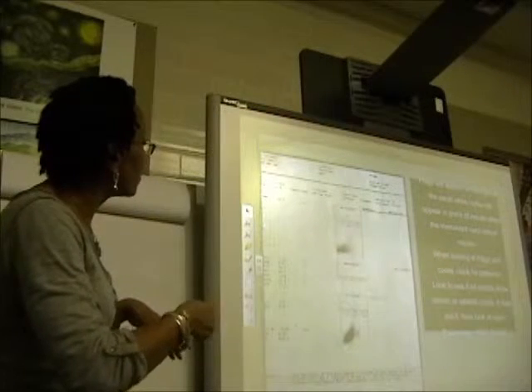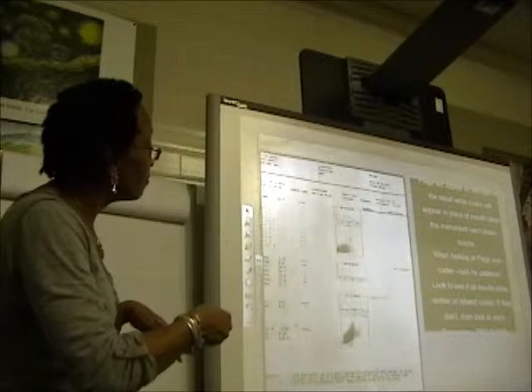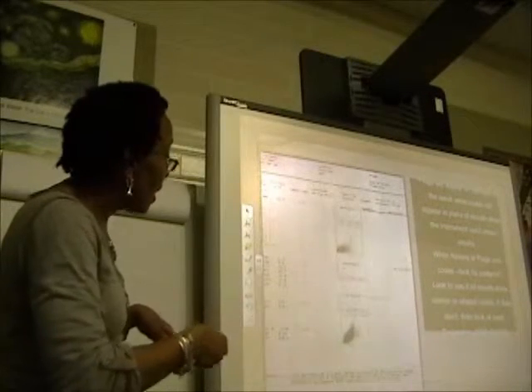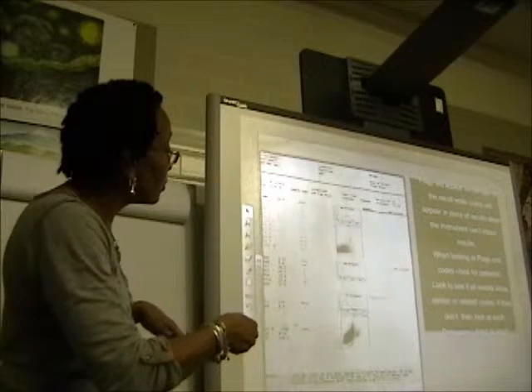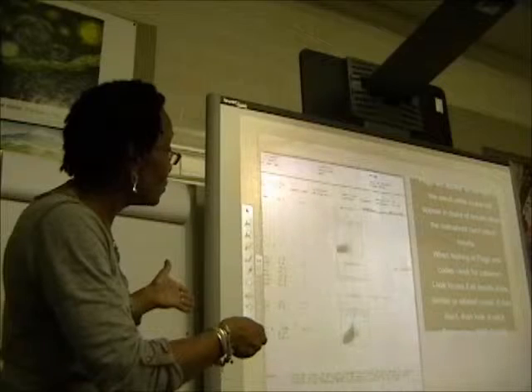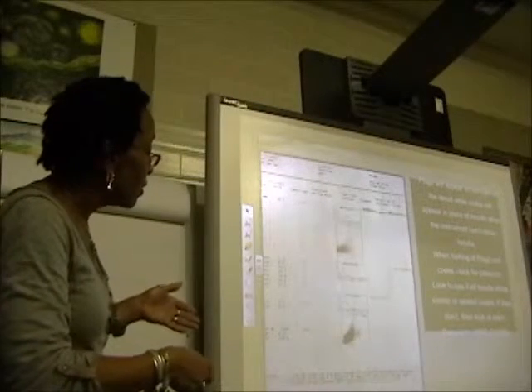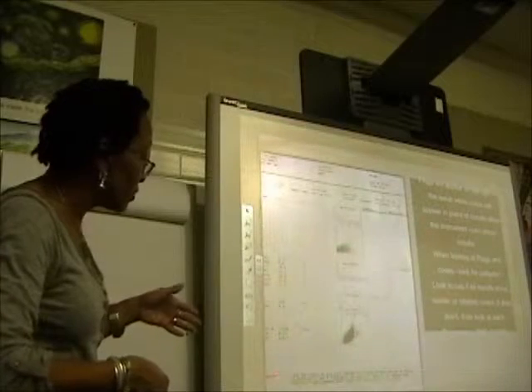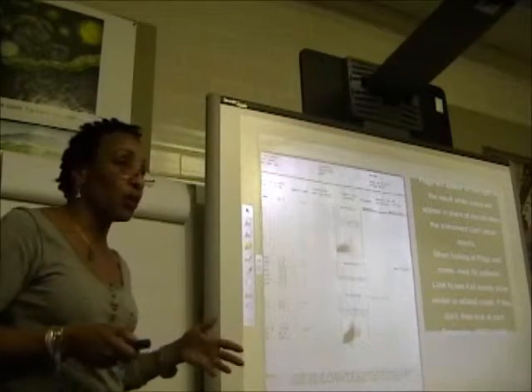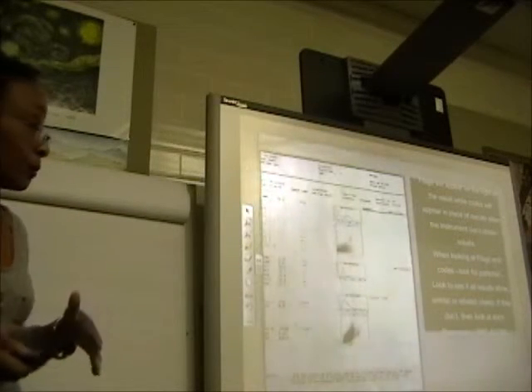You don't have any results here for the automated differential, okay? You've got all of that garbage right there. Your histogram kind of looks funky. And so you've got what the instrument says it is. It's high reticulocytes, and you've got that down there in the data plot. So the instrument is going to give you a set of comments, suggestions as to what you may want to do so you can get a good result before you put it out.